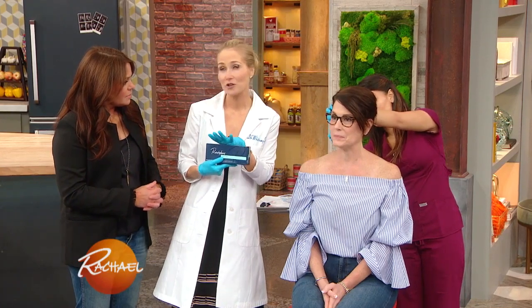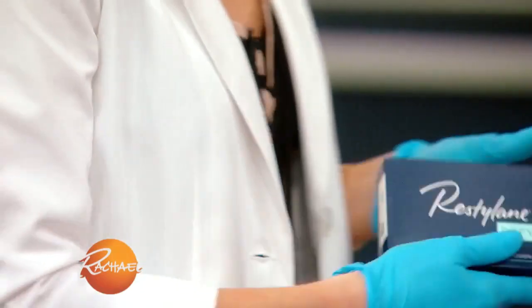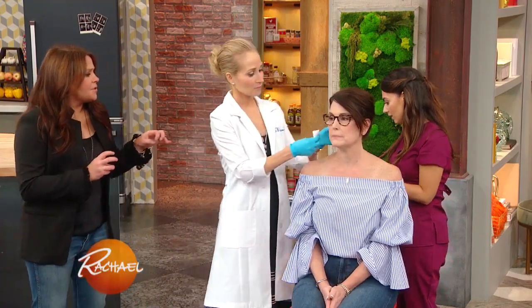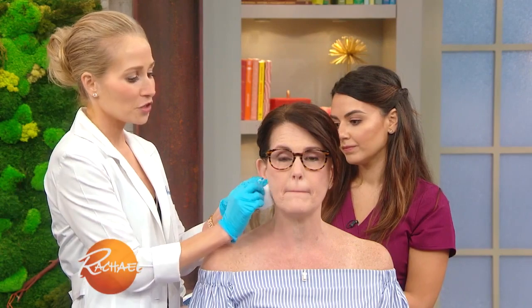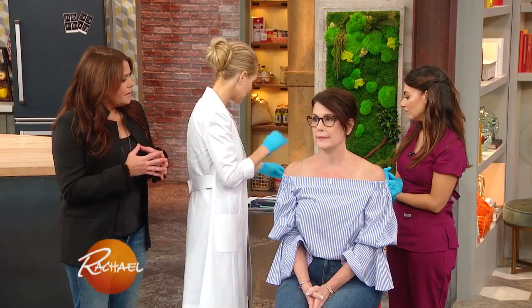And it's by simply putting fillers into the earlobe. The bottom part of your ear. Yep, you got it. The filler that I'm using is called Restylane Define. This was recently FDA approved, and it's one of my new favorites because it's super flexible, so it feels really natural. We always want it to feel like it's part of your natural skin. What kind of cost would you be looking at if you went to a dermatologist to get this? $500 to $1,000, depending on how much damage you need to correct. But it lasts a long time. Unless she goes back to wearing heavy earrings every day, it should last for at least a year.